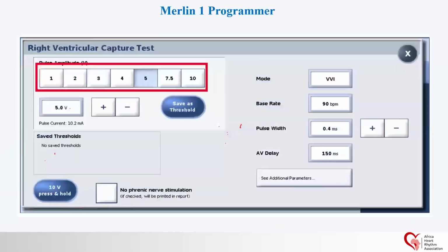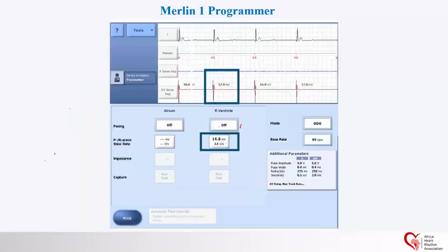And the other point, please: sometimes we will have a negative QRS. That sign is dangerous. That means you already perforated, because you detect the activity from the other side. We don't detect the signal exactly from the local myocardium, we detect an epicardial signal. We have to notify our doctor immediately. Maybe your lead perforated through the septum, whatever its position.